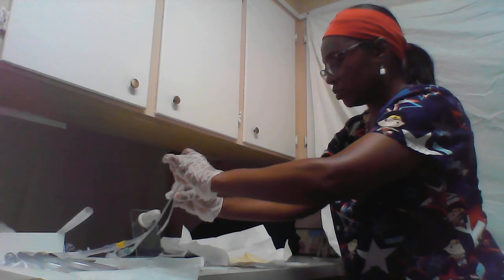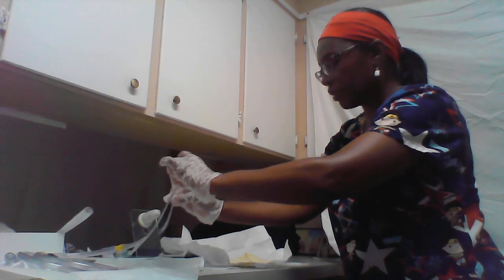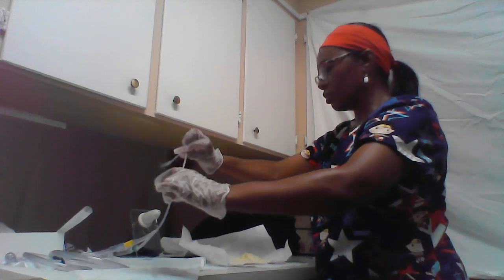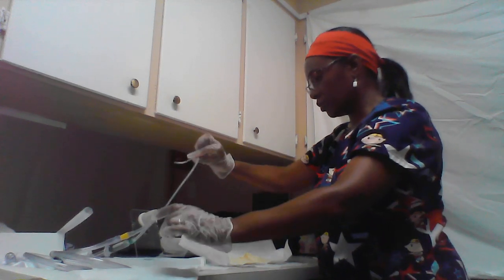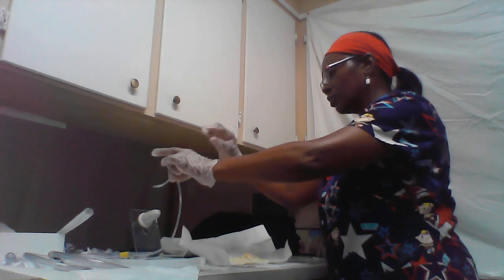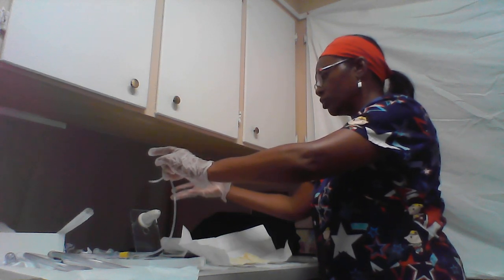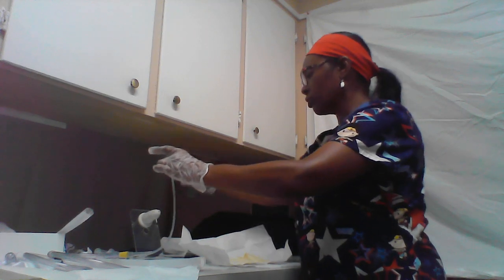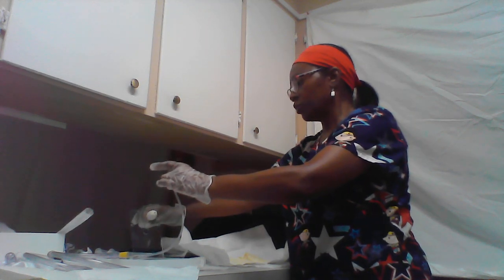Now I'm going to coat this catheter with gel, maintaining sterile field. Everything's still in the sterile field. And now since I'm going to be using this hand, I'm going to use just this hand to insert the catheter while I hold the penis.